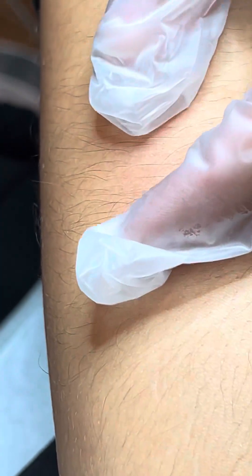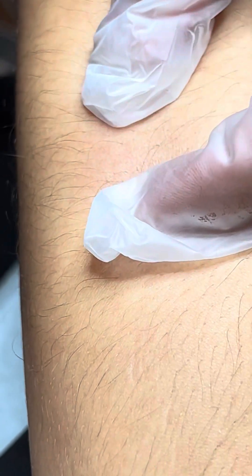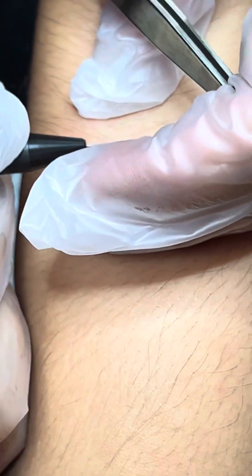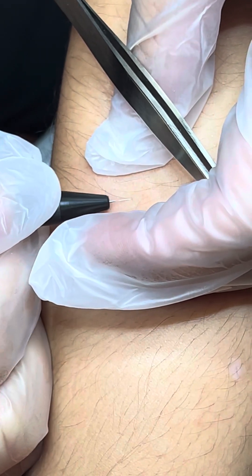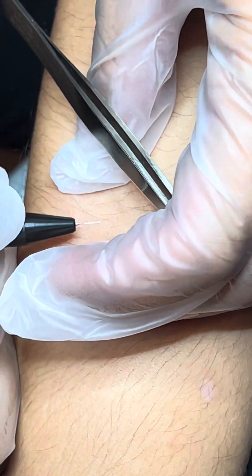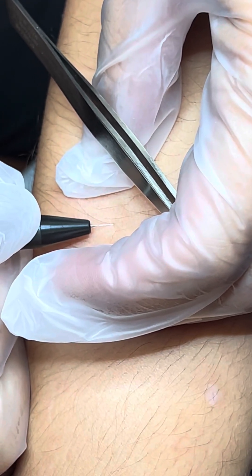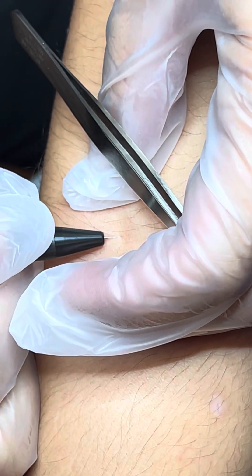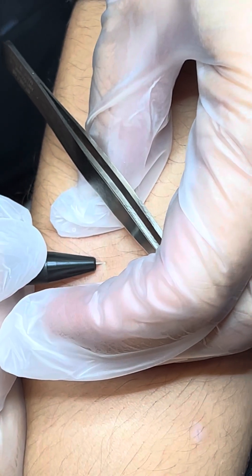The hair is like stuck. That's okay — go ahead and find another one, sweetie. Okay, we're doing very good. Yes, for your first time probing, you're good. Don't try to dimple — if it starts to dimple, pull back out. You're good, you're already in. Once you're in, you've got to commit.